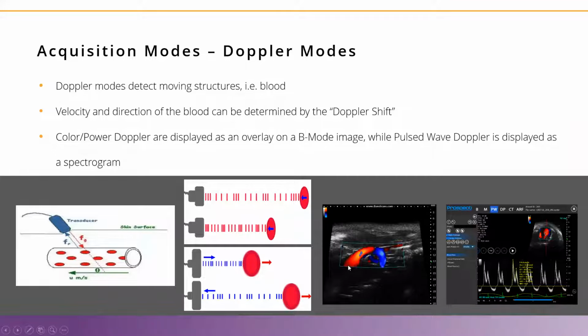So this is actually the ascending aorta as it comes out of the heart. As it takes a turn, goes through the aortic arch, and we can see the three branches being the innominate artery, left common carotid artery, and left subclavian artery coming off.